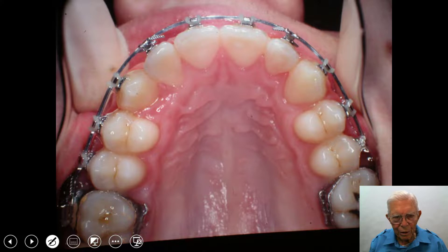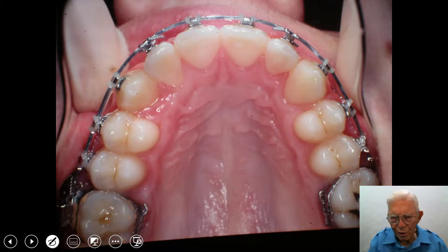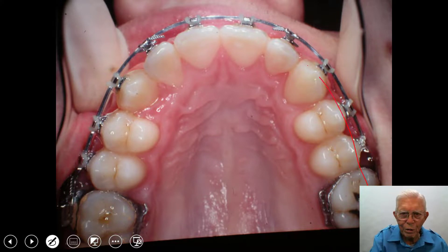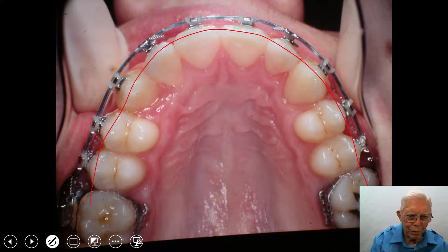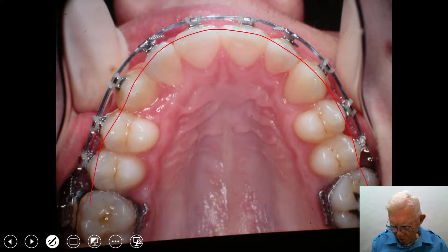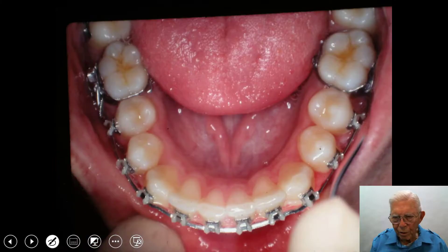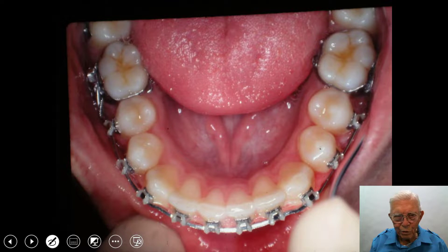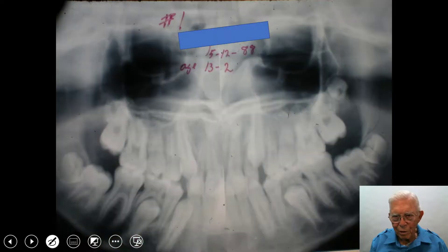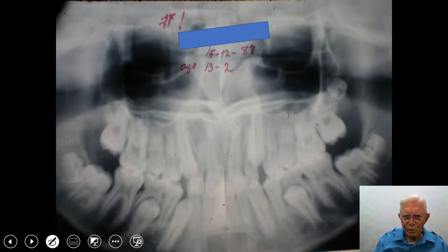Now the upper arch is lined up, and we've got all the teeth in place. It's lined up good. There's a rectangular wire on that. And the lower teeth — they're lined up. We don't have the wisdom teeth in there yet, but let's go back to the x-ray.